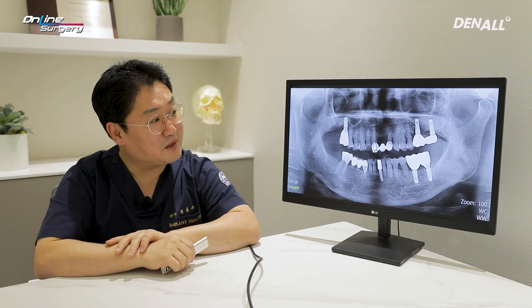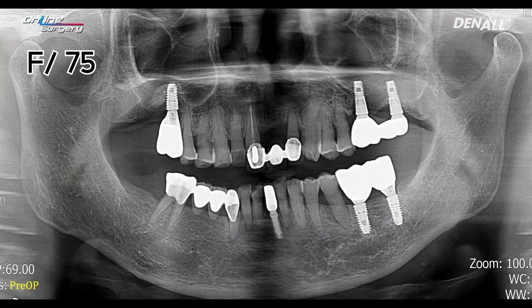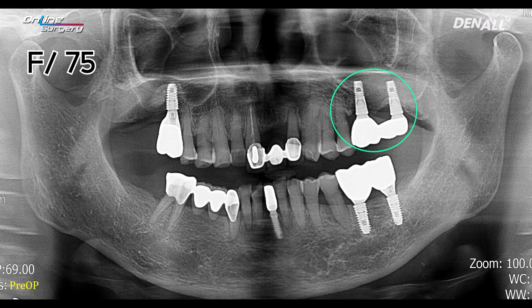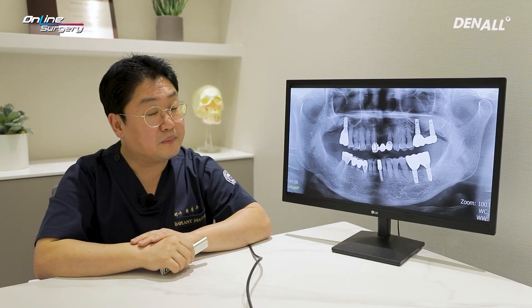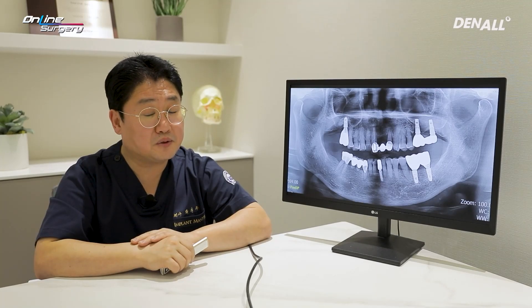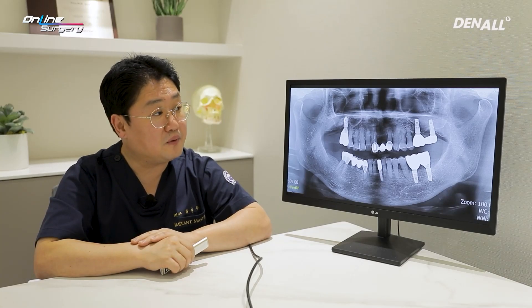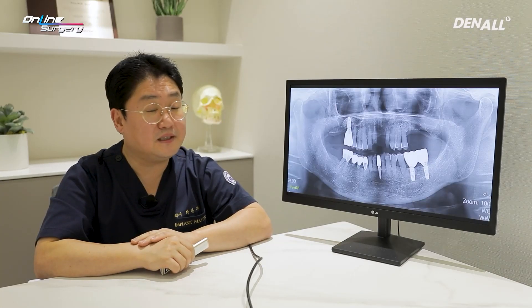Let's take a look at the patient. In the past, in the upper left posterior area, a lateral window approach was performed to do a sinus lift. A long implant was placed and the patient has been using it nicely for over a decade. Periimplantitis occurred and because of continuous inflammation, the decision was made to remove the implant.